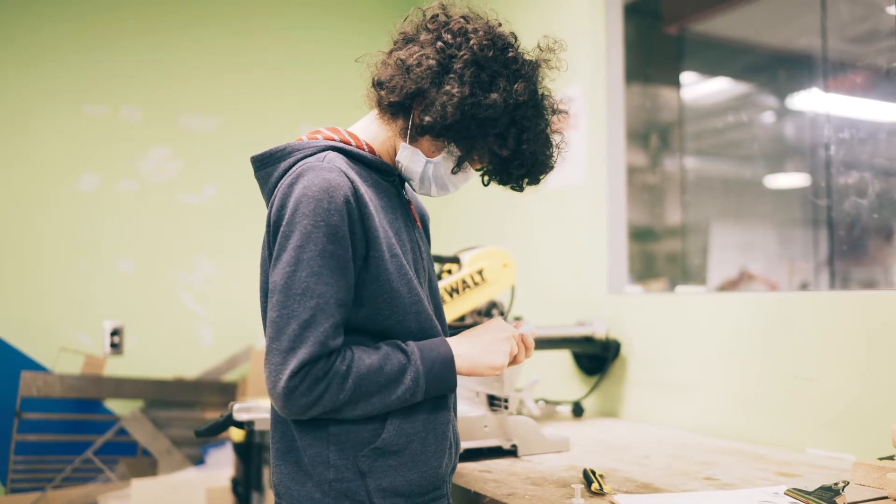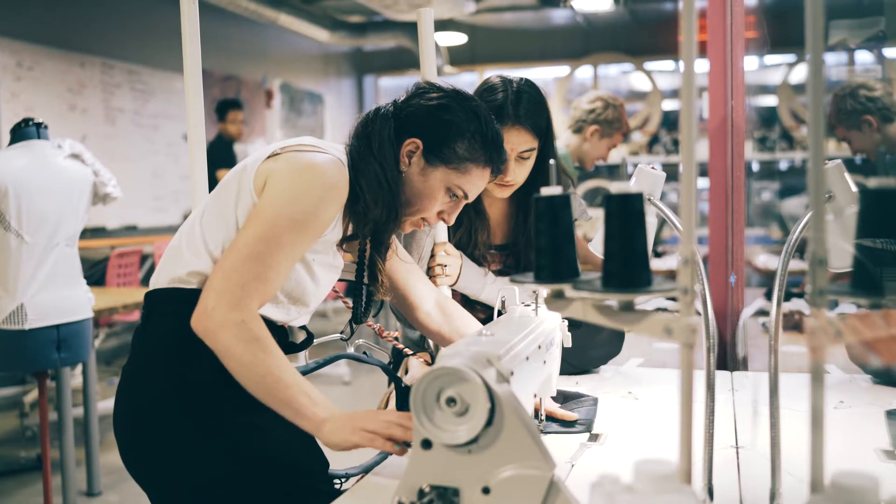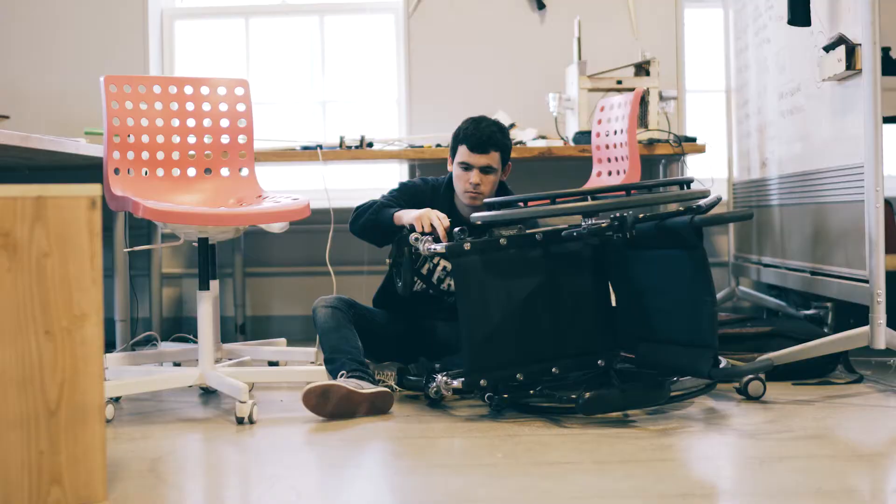Students are working with Ross Lilley of Access Sport America. They are making devices to help five people with disabilities with things such as fishing, typing, dancing, arm movement, and photography.